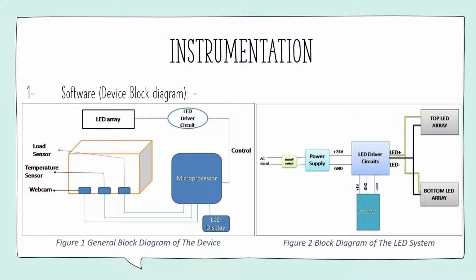So in the cage here, on the left side, where babies will be placed, there will be a load sensor, temperature sensor, and webcam, and the LCD for displaying the data you need to put in the device. And also the circuit is explained on the right side.